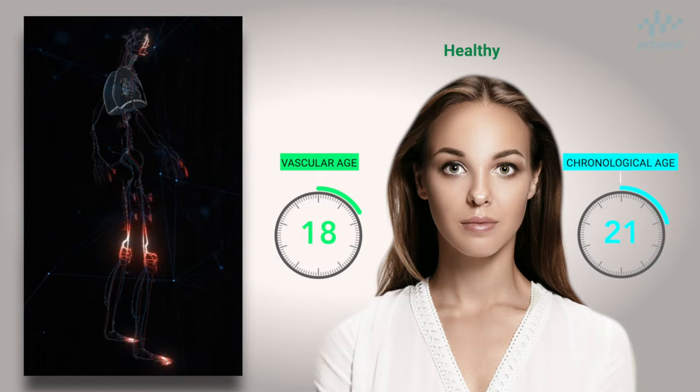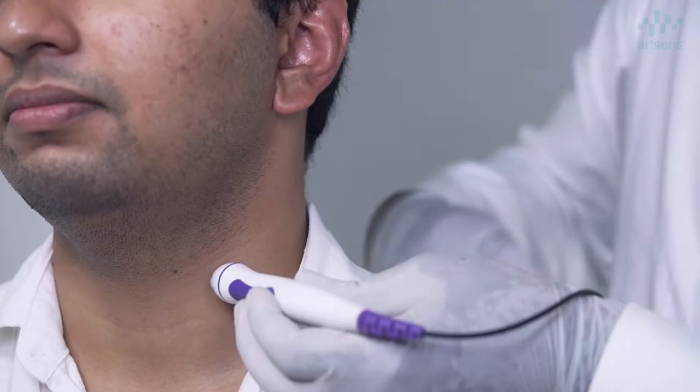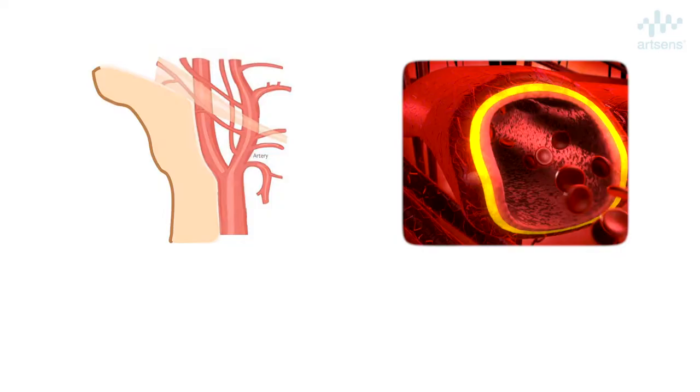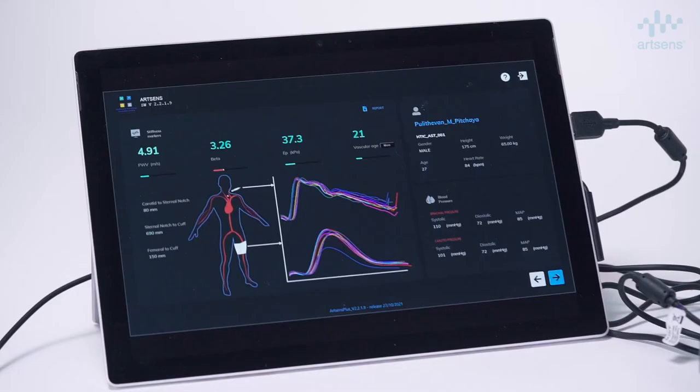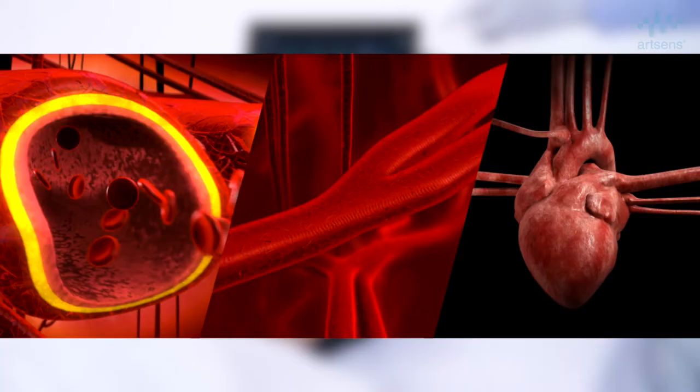A vascular age lower than the chronological age indicates a healthy individual, whereas people with a higher vascular age need to modify their lifestyle or medications to avoid future adverse events. ArtSense is a portable, easy-to-use, non-invasive device that measures early vascular aging markers such as carotid arterial stiffness, aortic pulse wave velocity, and central blood pressure — all in a single test. It eliminates the need for expensive imaging systems and expert operators, reducing costs and expertise required to perform vascular screening. ArtSense combines multiple vascular measurements and risk factors to provide a single vascular age metric.